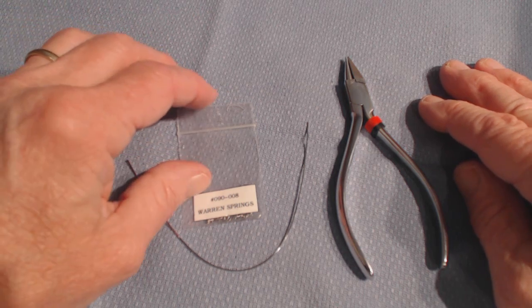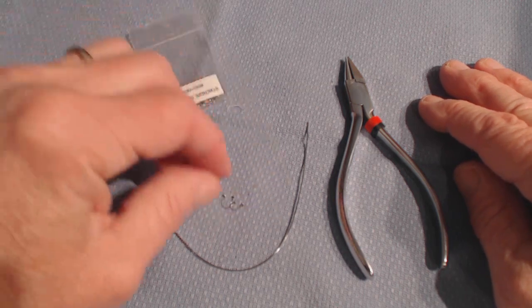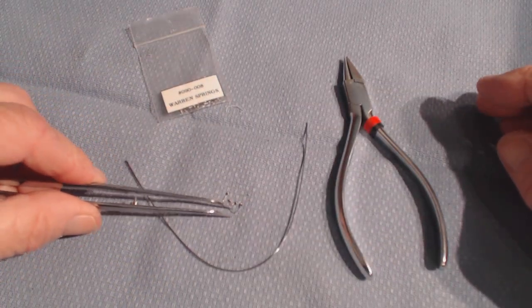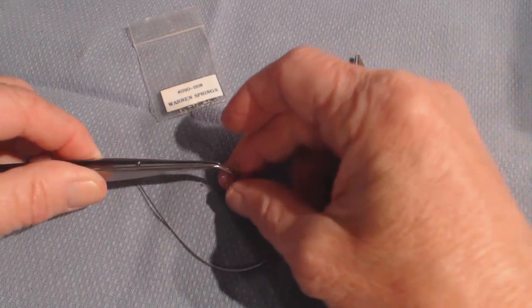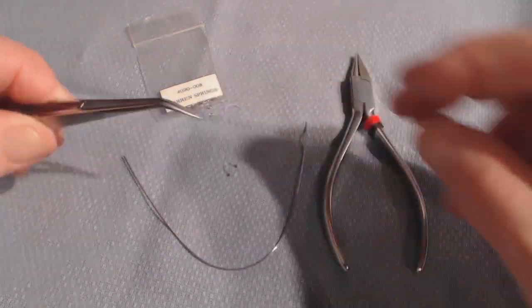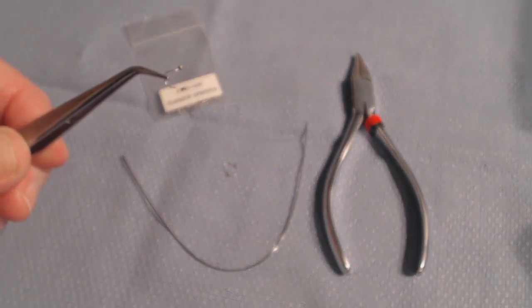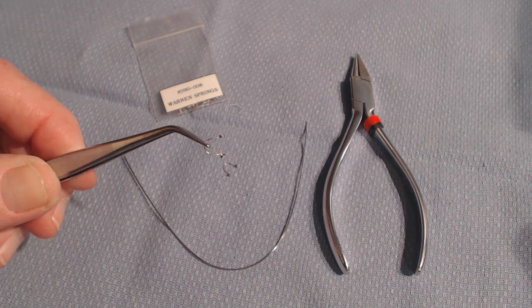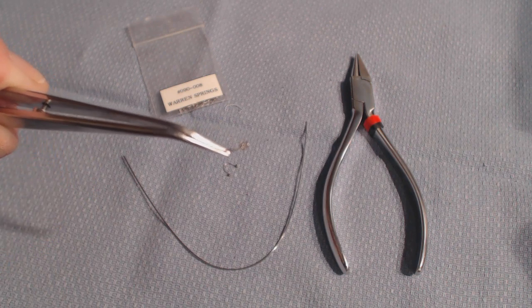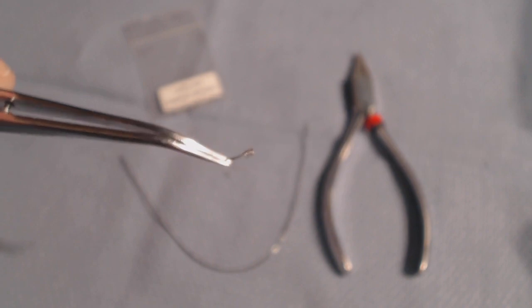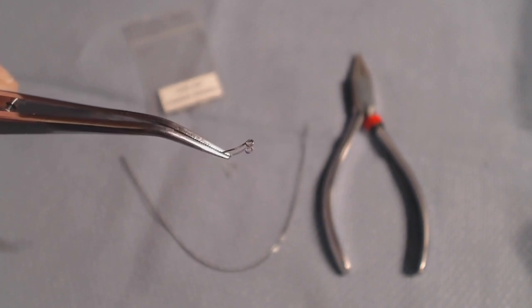So let me show you what a Warren Spring looks like in detail, and I will pick it up here with the plier. I don't want two, I just want one. And you can see this will fit around a bracket, and it's got a little hole in it that the wire is going to go through. Let me show you that up here in detail.